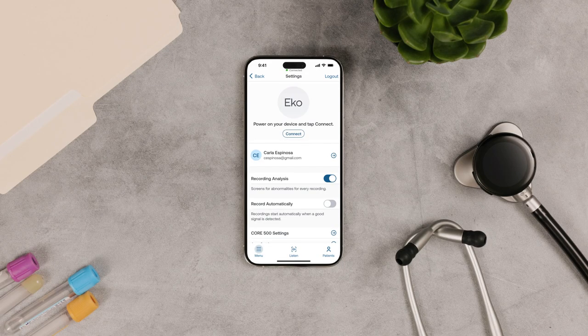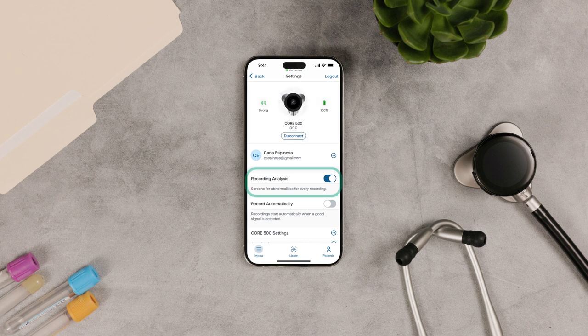Open the Eko app and make sure the CORE 500 is connected. Recording Analysis uses Eko AI to check for signs of heart disease for every recording.